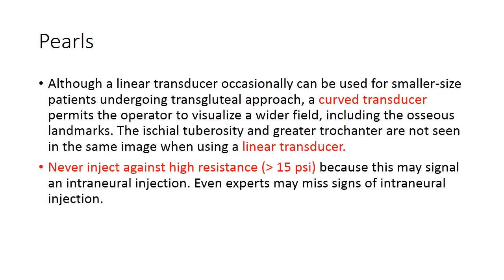Let's check out some clinical pearls. First, I usually prefer a curvilinear probe over a linear probe, as one can visualize a wider field including osseous landmarks. Second, never inject against high resistance, 15 psi.